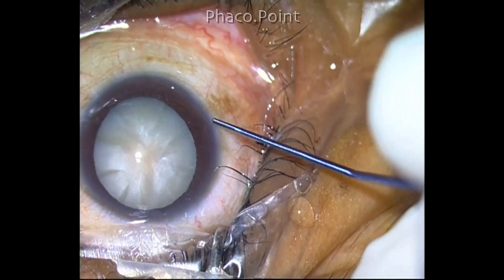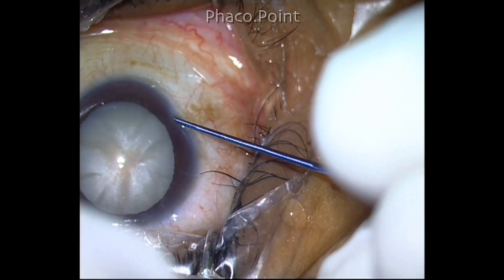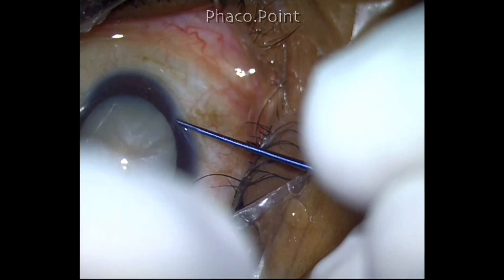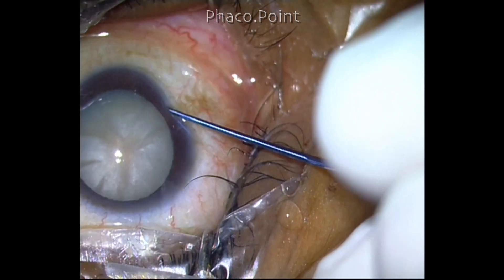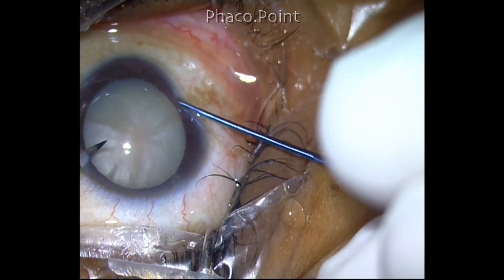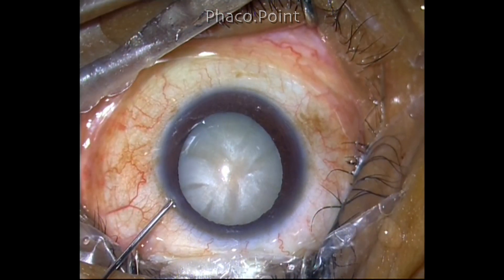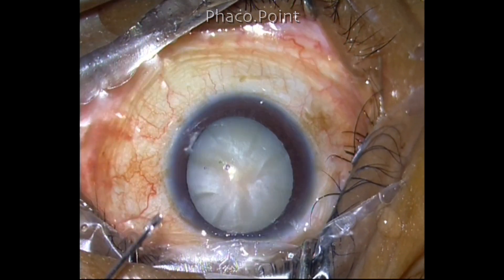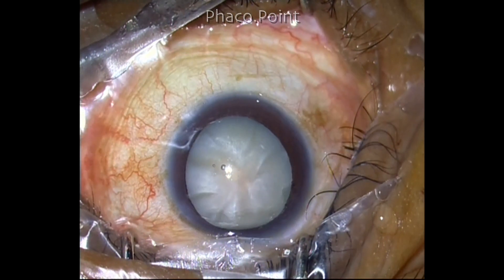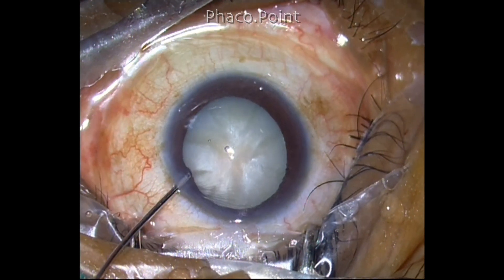The patient was tending to squeeze the eye a bit and was tending to look slightly laterally. The corneal pocket incisions were made in order to take a firm fixation of the eyeball. A side port incision is then made and 1% lignocaine or xylocaine is injected. A few CCs is injected into the anterior chamber followed by trypan blue. Give sufficient time for the stain to take up.